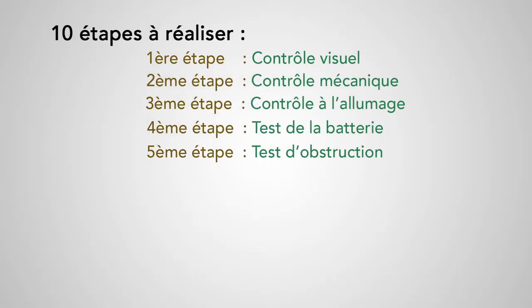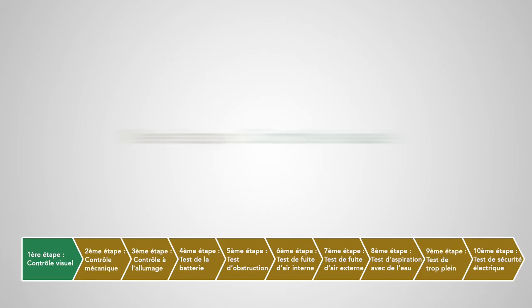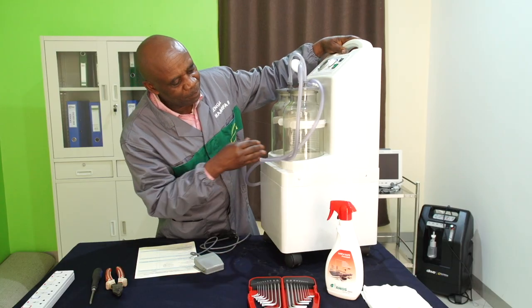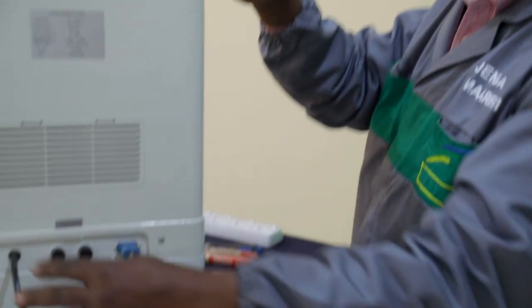La procédure que nous vous proposons ici se décline en 10 étapes. Première étape : contrôle visuel. On va vérifier tout d'abord si l'équipement est propre et si tous les câbles et accessoires sont présents.